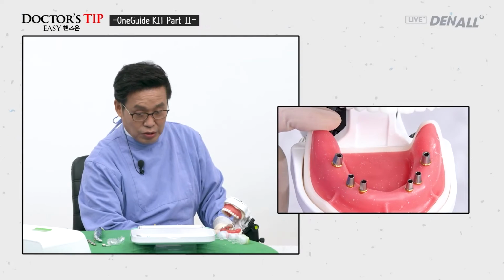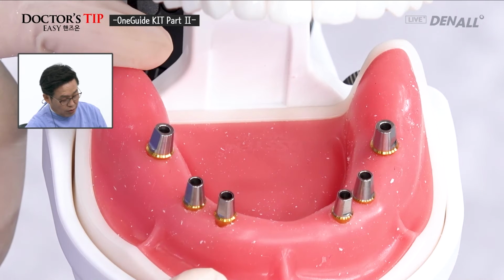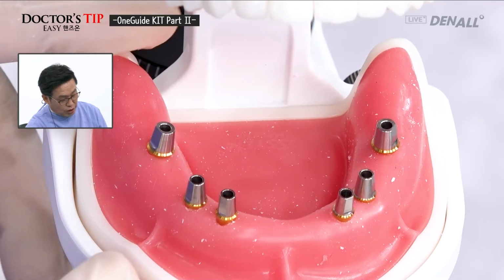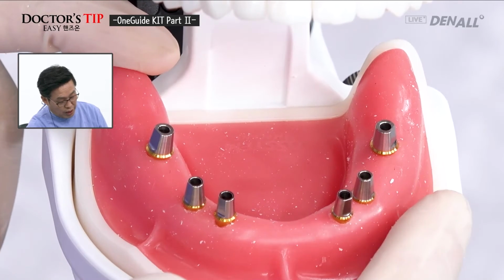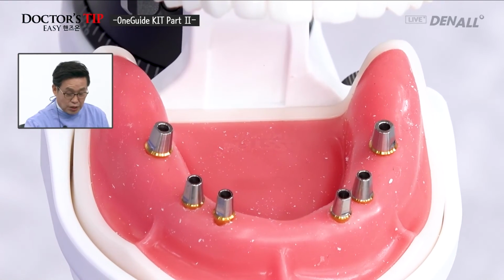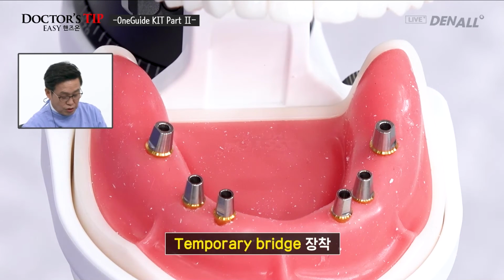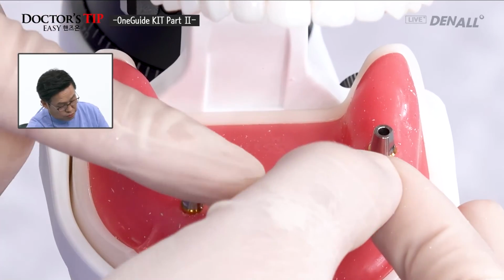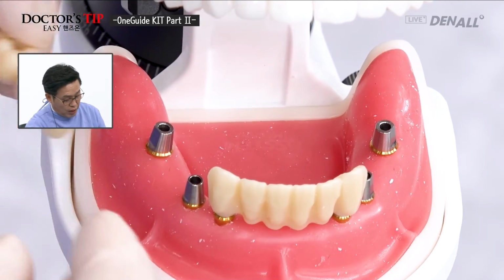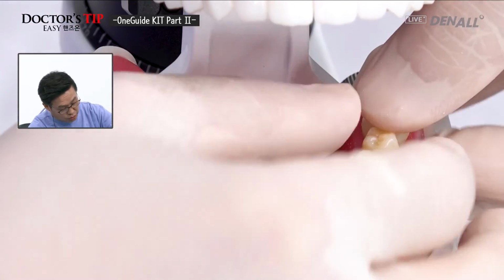Using OneGuide template was used to place 6 implants in the canine, premolar, and first molar region, and hex control is done. So abutments have been connected. On computer, we have planned a provisional restoration, and we're going to connect it first on the 6 anteriors using canines as support, the 6-unit bridge, and in the posterior region, 3-unit bridge is going to be connected.